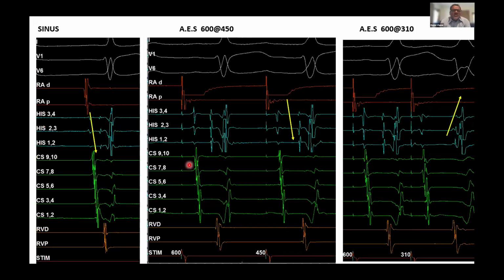Yeah. It is very useful to see what the atrial activation pattern is during tachycardia and during sinus rhythm. Normally, the way the catheters are positioned in the atrium, we can see proximal to distal activation in sinus rhythm. And if there is a distal to proximal activation, and you know you connected your electrodes right, it will give us a clue. Yes, we have to think of it when we are not able to get the pathway easily in the annulus, but it's a very unusual tachycardia.